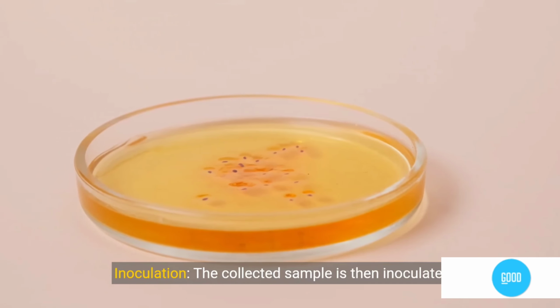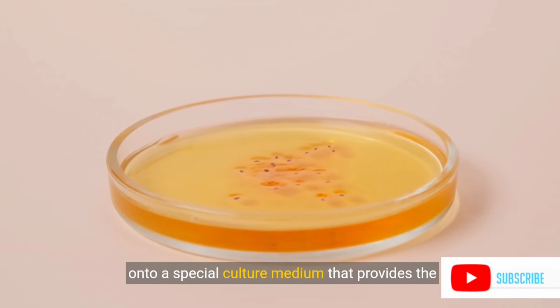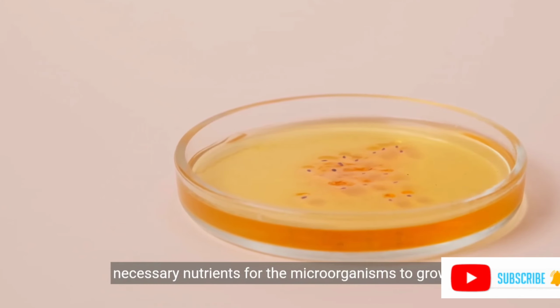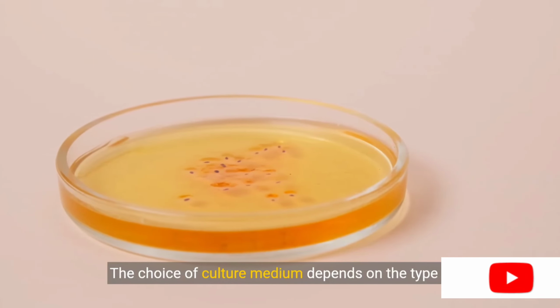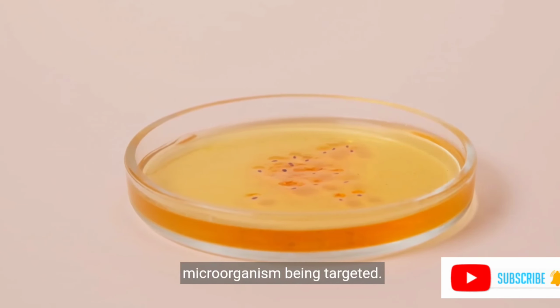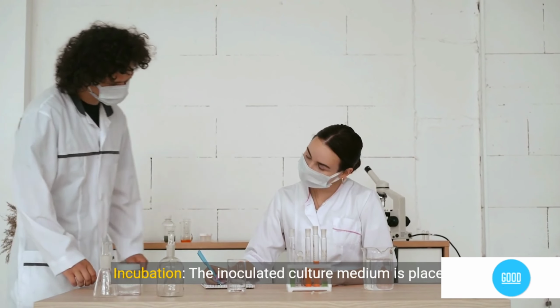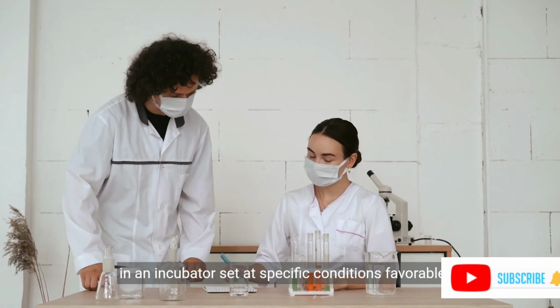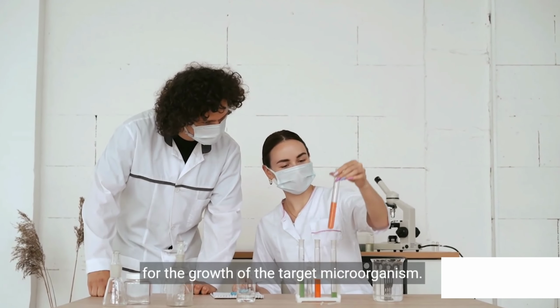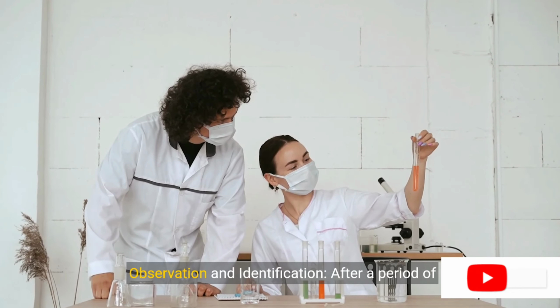The collected sample is then inoculated onto a special culture medium that provides the necessary nutrients for the microorganisms to grow. The choice of culture medium depends on the type of microorganism being targeted. Incubation. The inoculated culture medium is placed in an incubator set at specific conditions favorable for the growth of the target microorganism. Observation and identification.